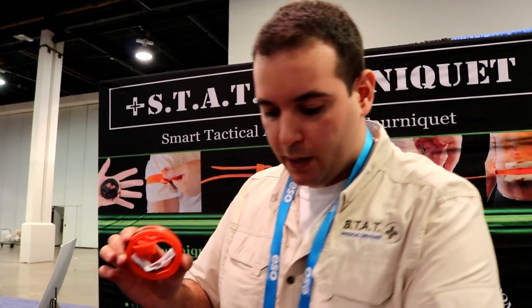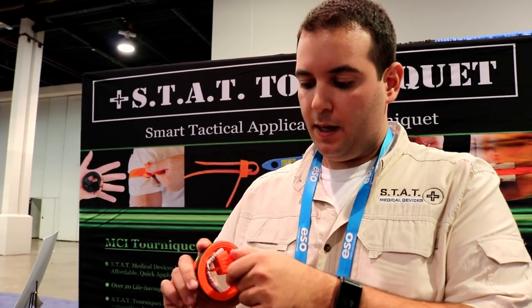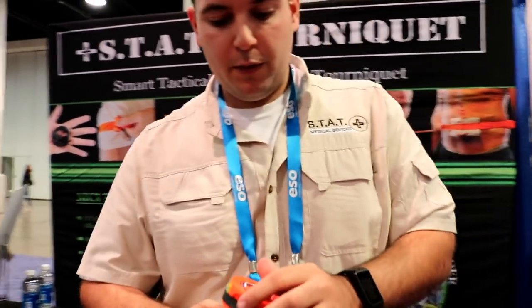It does come packaged usually like this. For undercover use, they can put this in the back of their pocket — it looks like a can of chew. You would never know the difference. It's a pretty small, compact package. You can even put your rubber gloves in the middle if you need to.